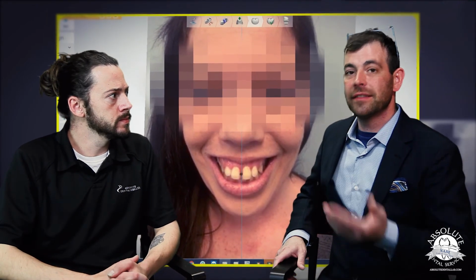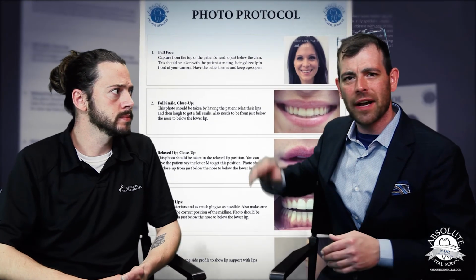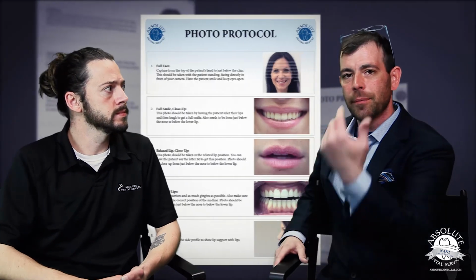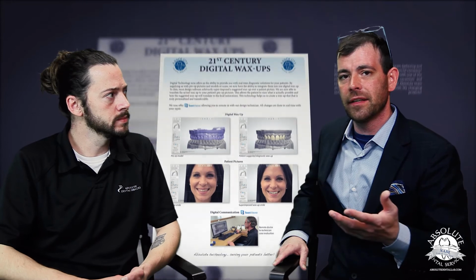And a lot of times too, with the design capabilities we have in 3Shape, we can incorporate a full face photo into the design software. So a lot of times what you can do with your patient also, beyond shade taking, is have them hold their head completely level, have them hold a box of Kleenex up against the wall, and take a picture straight on with a big smile. That way we'll be able to import that photo into the design software.